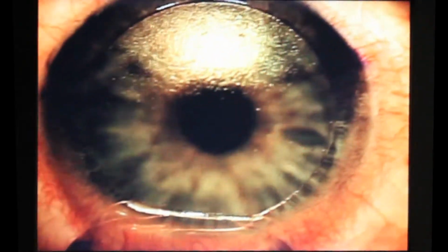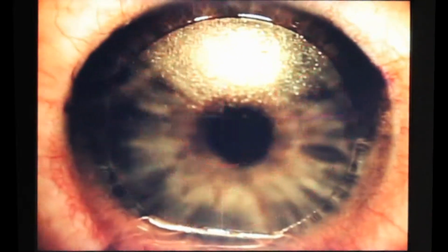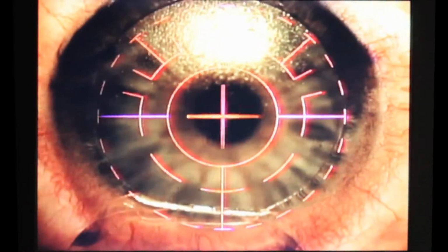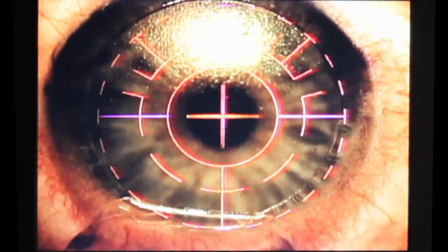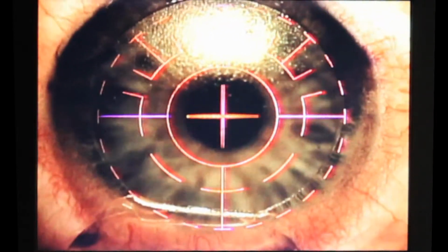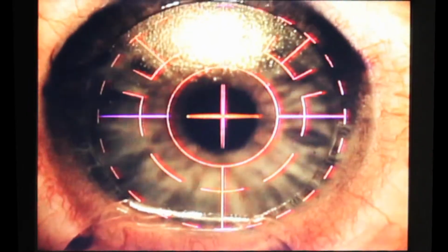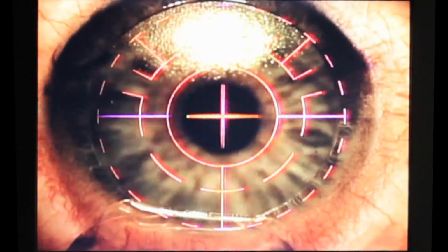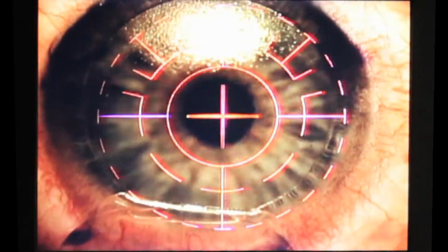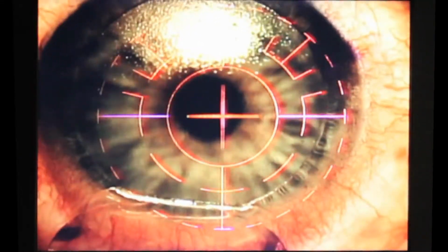The noise at that point is like a clicking noise. You can see he didn't acquire, so he had to lock back on and acquire. But it's like a tapping noise that you hear while this is going on. You can actually see the laser there. I don't know, it's like a bunch of sparks that you hear. You see a little smoke? See that smoke?